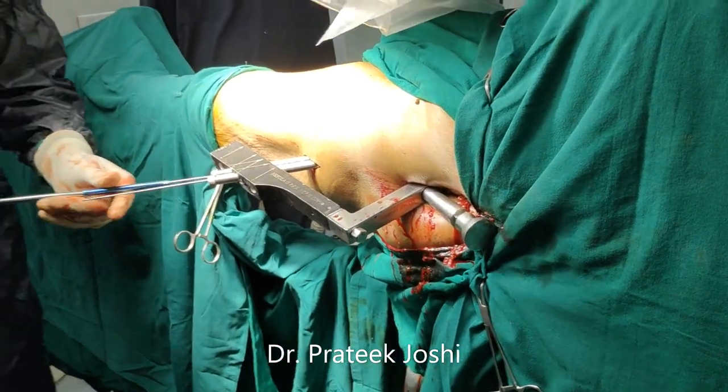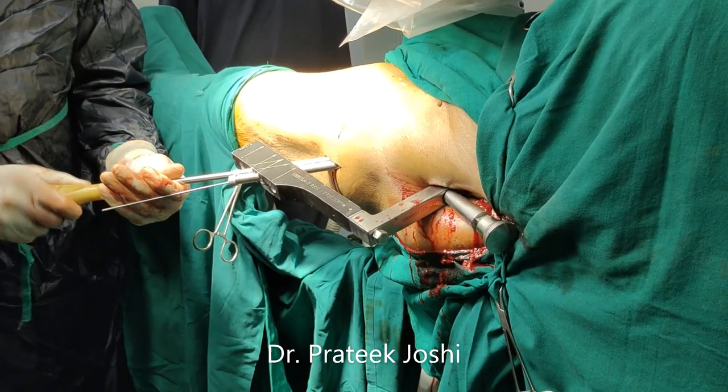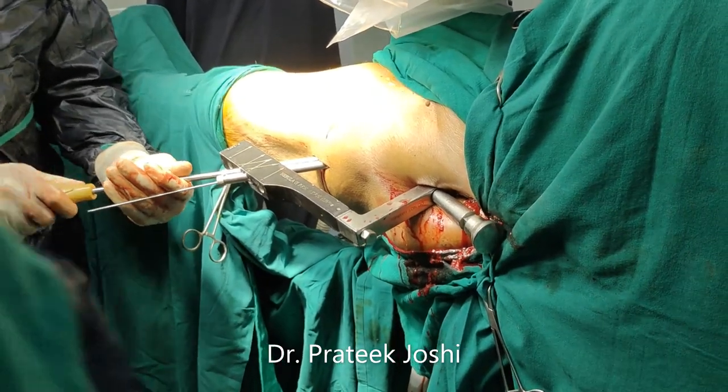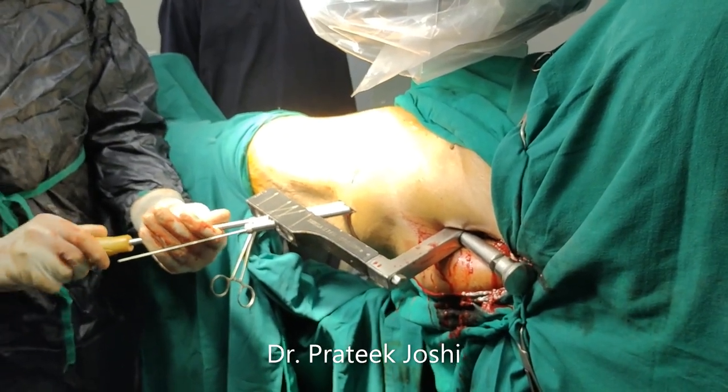Now both the proximal screws are inserted and then distal locking screw is also inserted through the jig. Distally usually we have two options, one is dynamic screw and other is static screw.